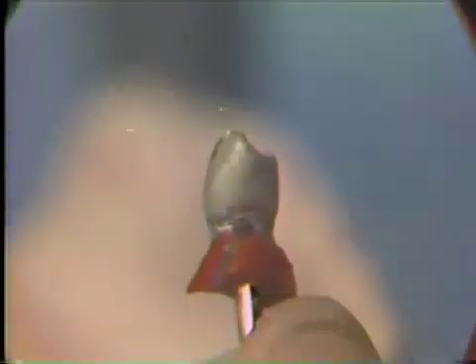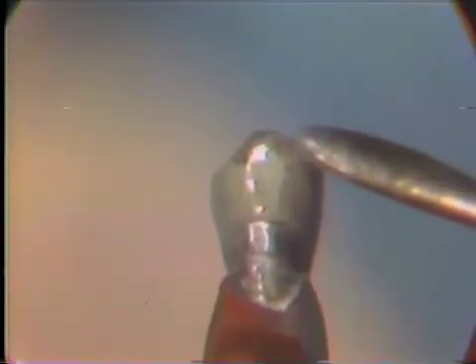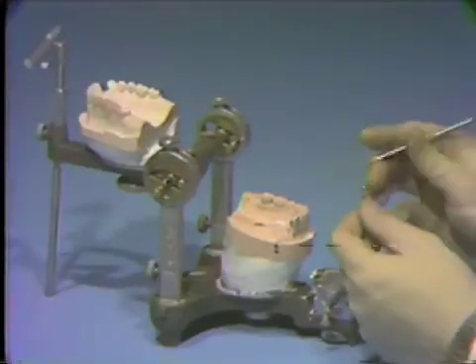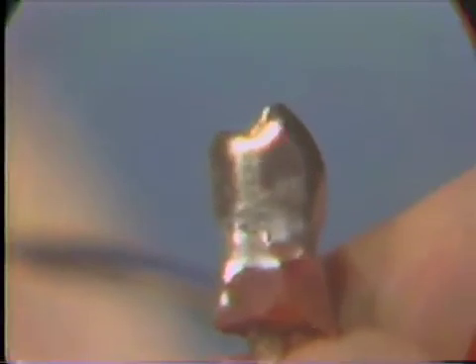Retouch the margins, invest and cast the pattern. The casting should be pickled, inspected for bubbles and investment, and cleaned in the ultrasonic cleaner if necessary. Cut off the sprue, remove any bubbles on the inner surface and try it on the die. If it is satisfactory, finish and polish the casting. Do not polish the parallel guide plane on the lingual, but do remove any roughness. The finished crown should be smooth, highly polished and with well adapted margins.